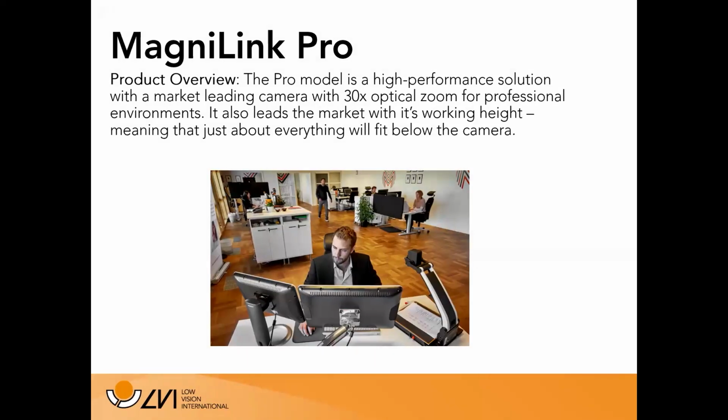And then we have the big sister of the Magnilink S, the Magnilink Pro. This product has historically been more popular in Europe, but we are seeing excitement build for this product here in the United States, especially for some professional environments.